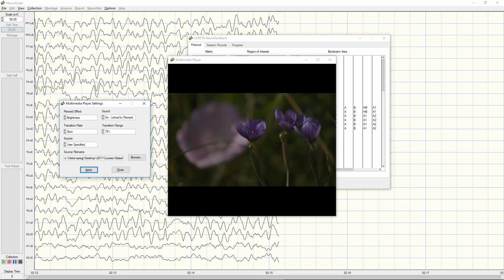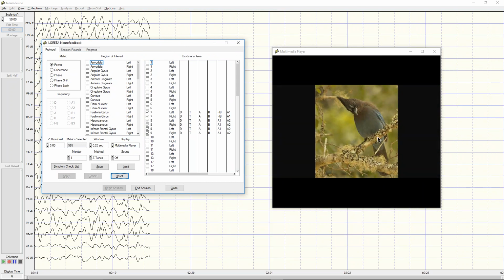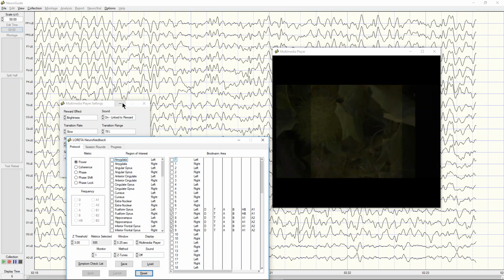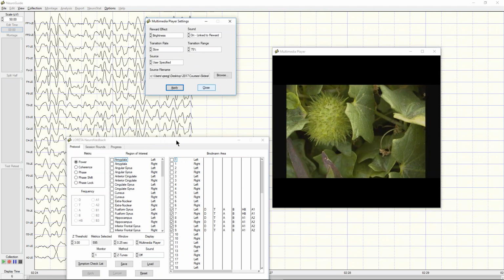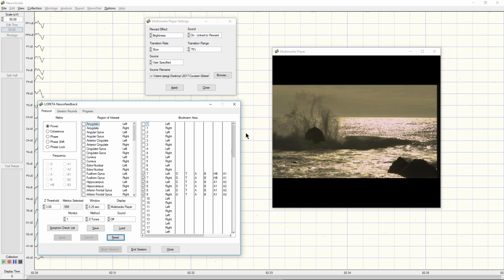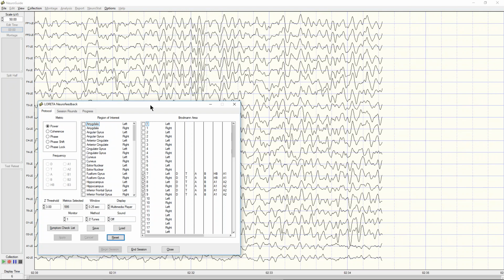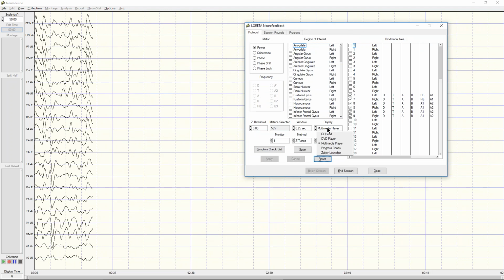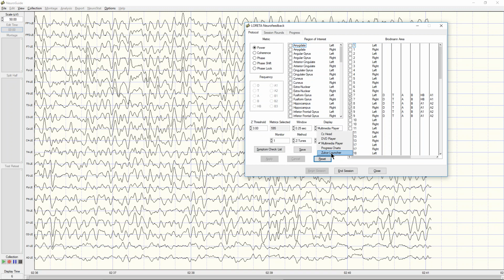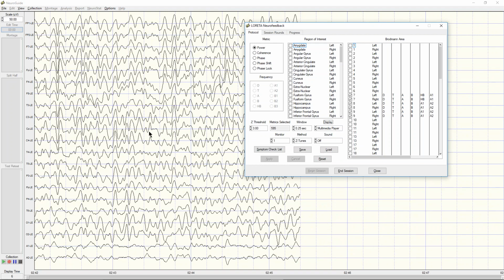And so now we've got a little slideshow showing pictures getting brighter and more dim, and we can change those settings as we like, and make a variety of changes in that. And there are a variety of other things we can do. Multimedia player, Z-score launcher, we can play a couple of Z-score games, and so on.